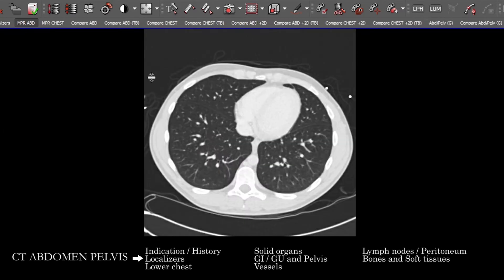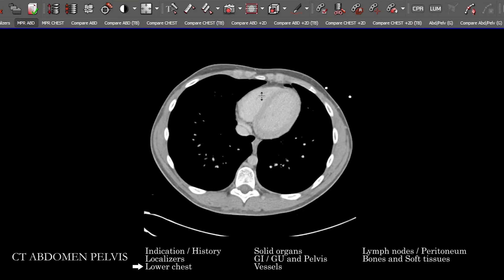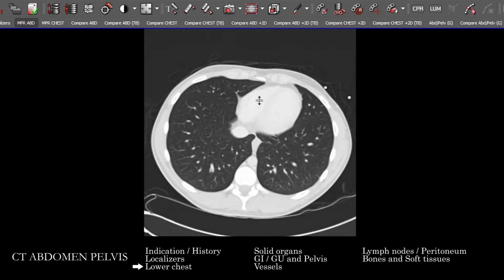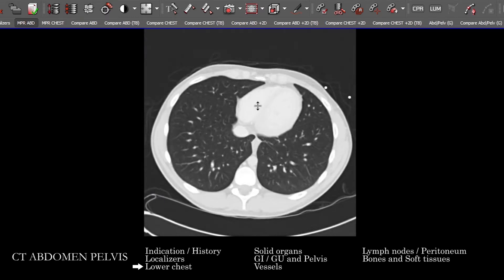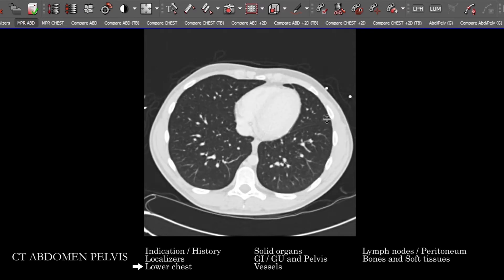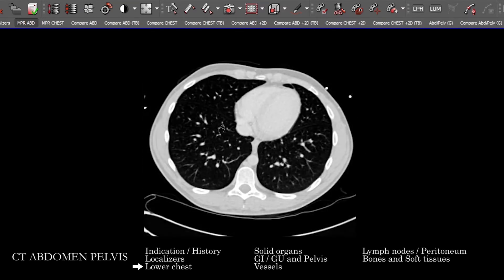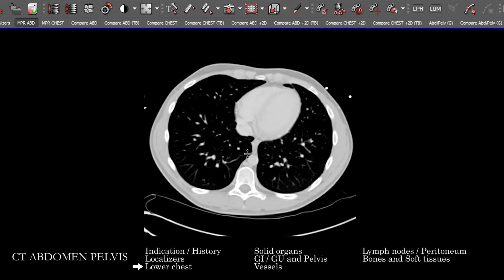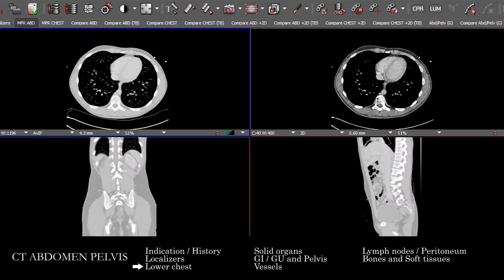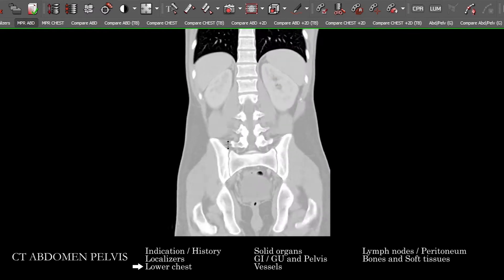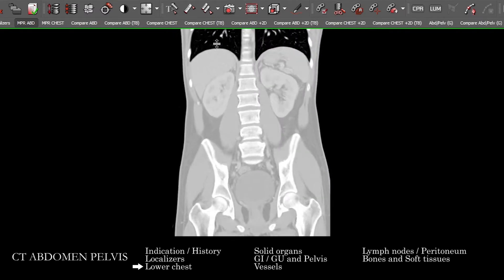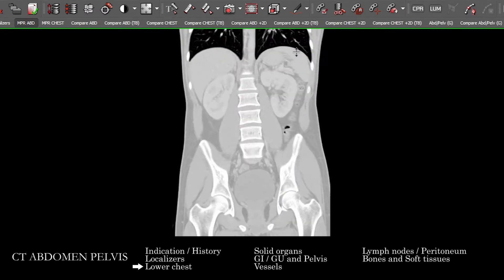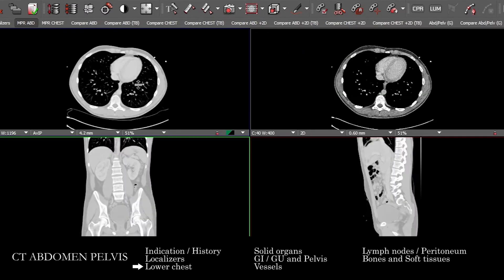Starting off the search pattern, I like to first take a look at the lower chest. Frequently people just look at the lung bases for abnormal nodules, consolidation, and ground glass opacity, but it's also very good practice on every study to look at the pulmonary arterial vasculature as you see it, especially on multiple projections, as you may incidentally see a pulmonary embolus or other sort of vascular pathology there.